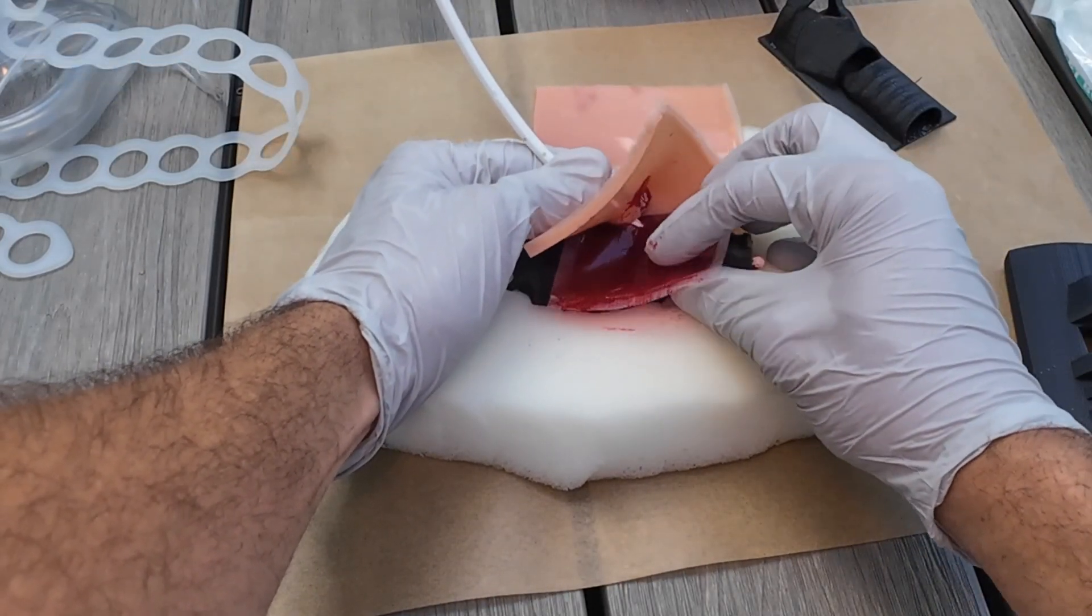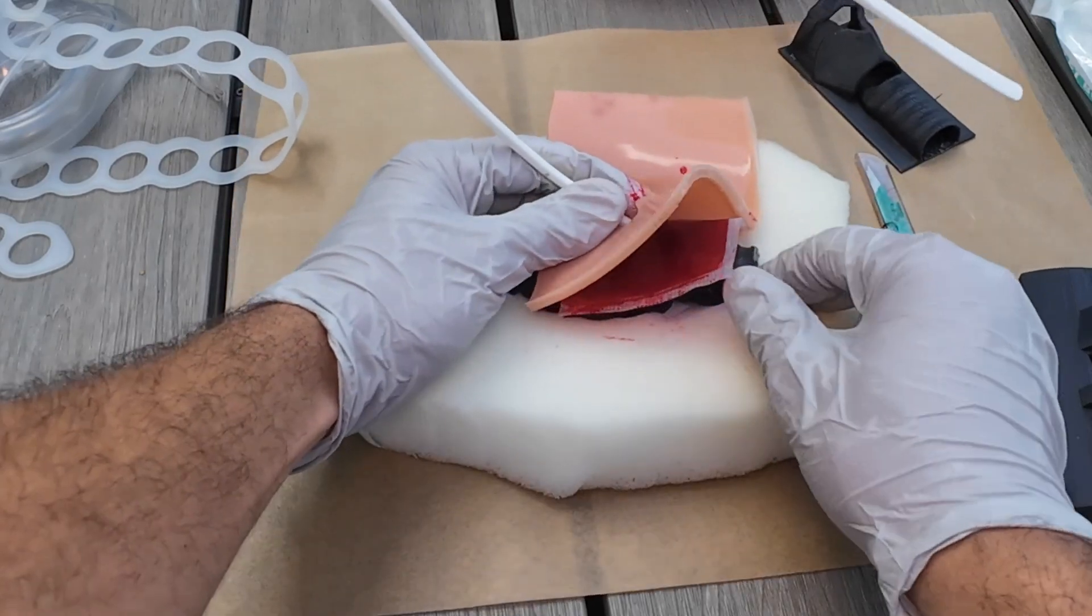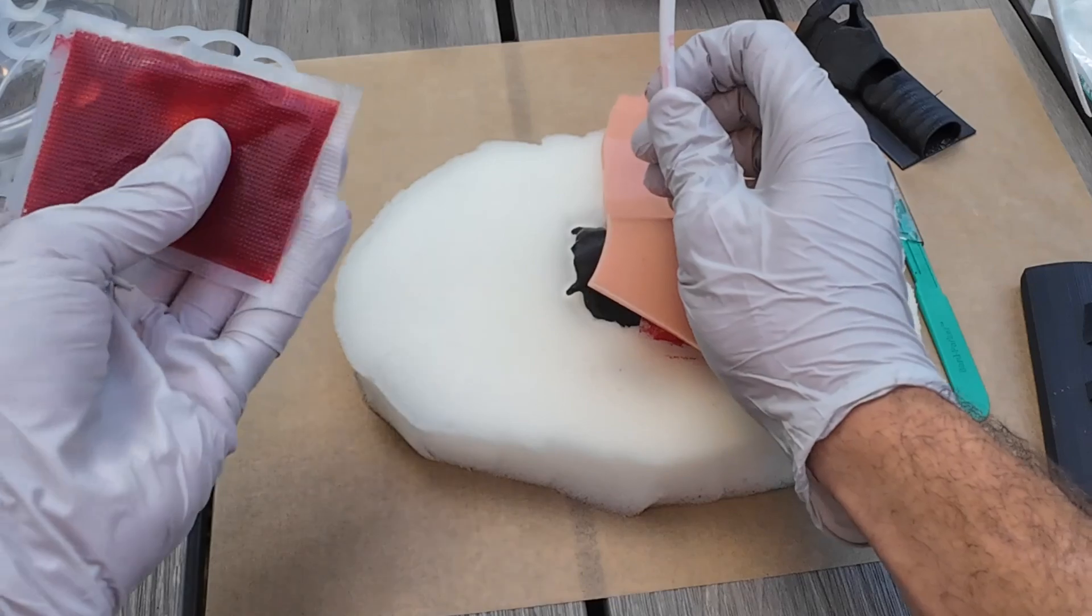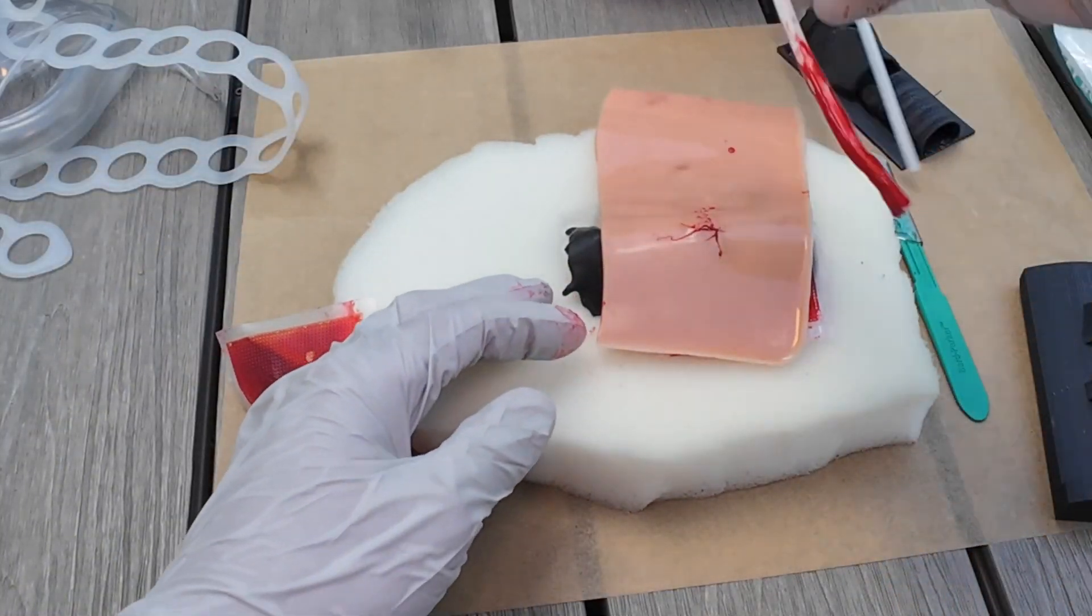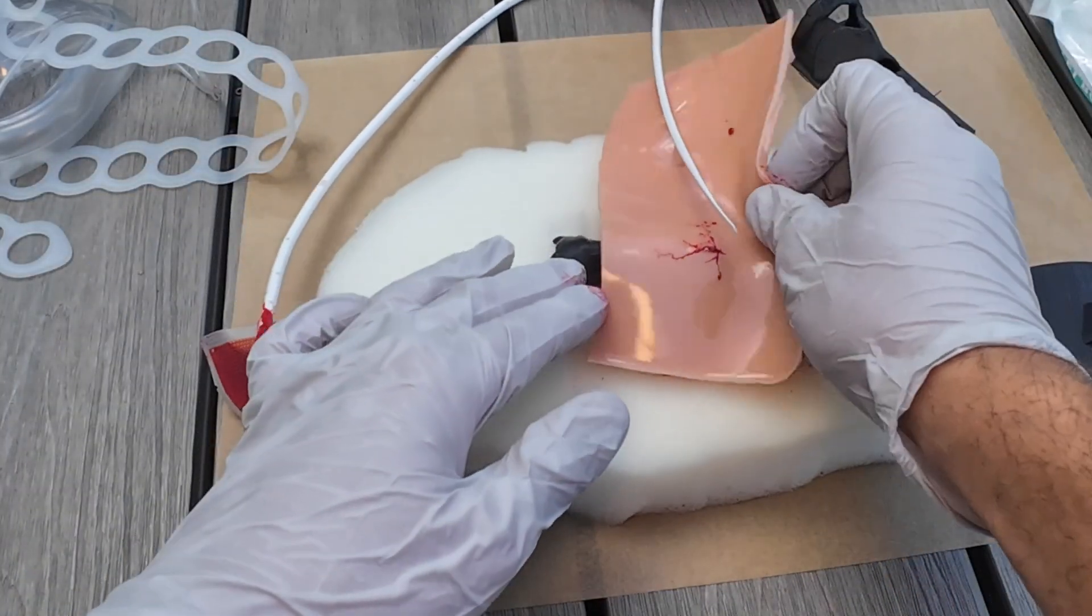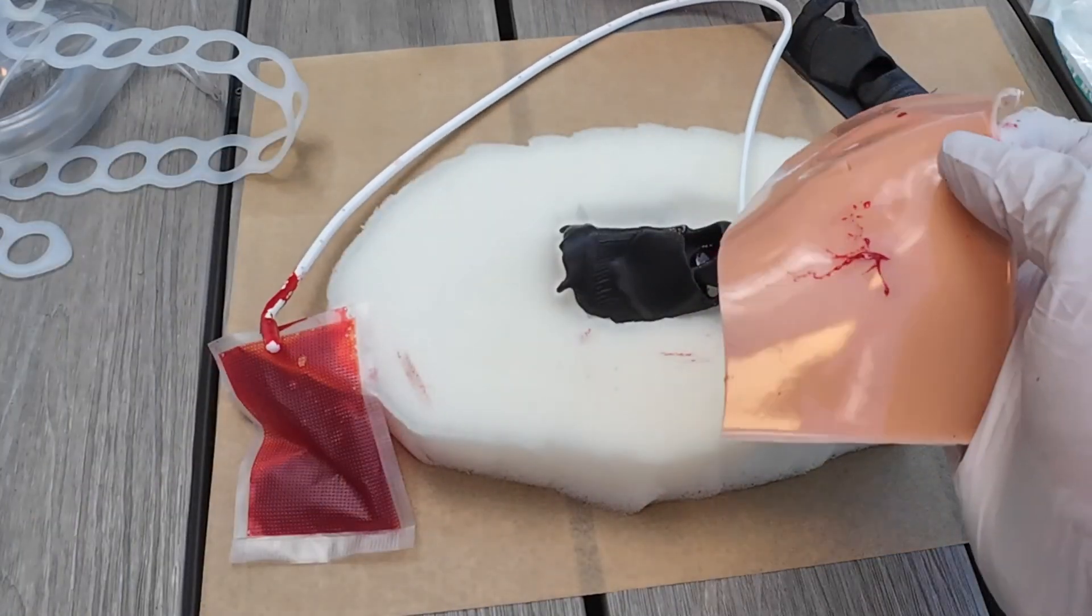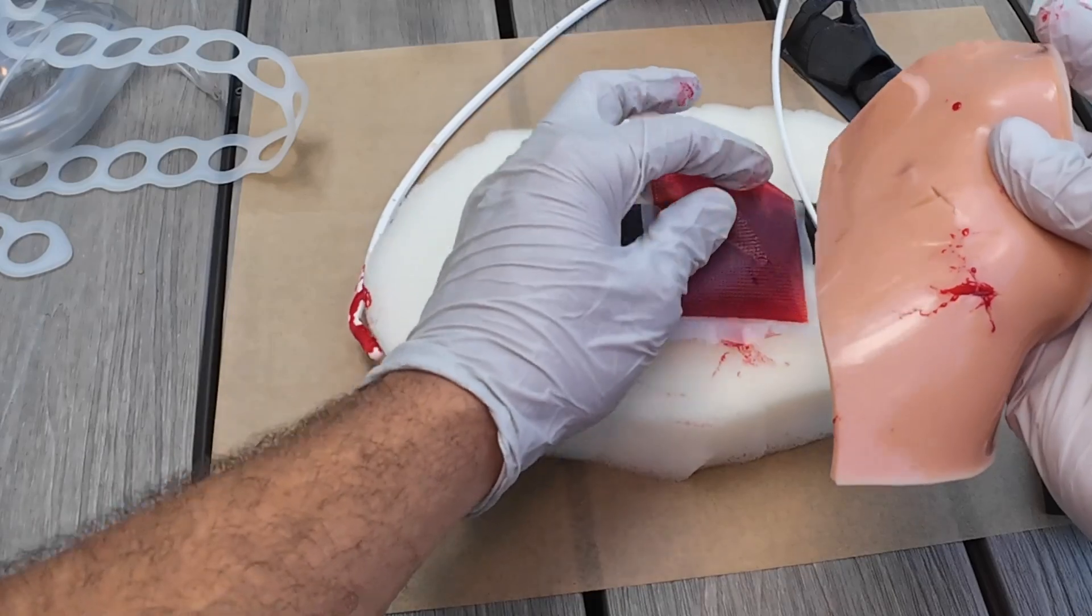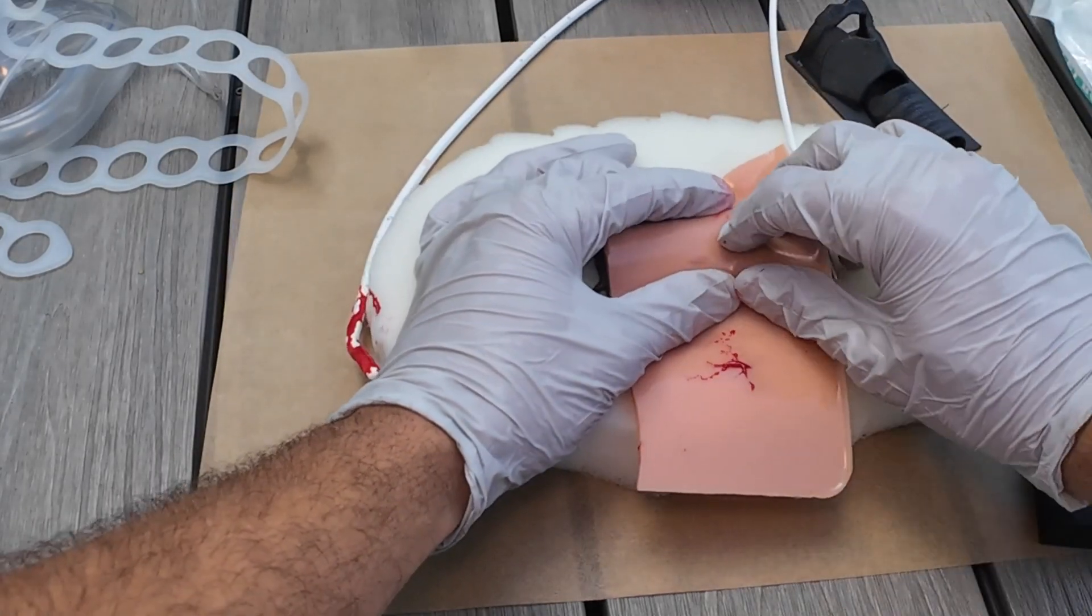So you can use that blood there. You can make it more liquid. We have one that's more liquid. This one's a little more gooey. This one's a little more liquid. So I'll show you what that looks like. There's your nastiness. So you take this, and remember these packs kind of create that cricothyroid membrane.